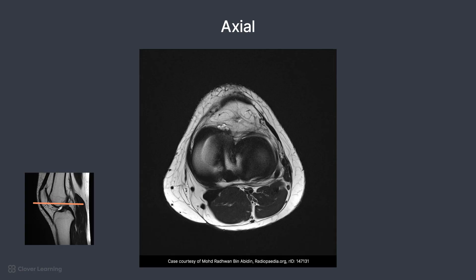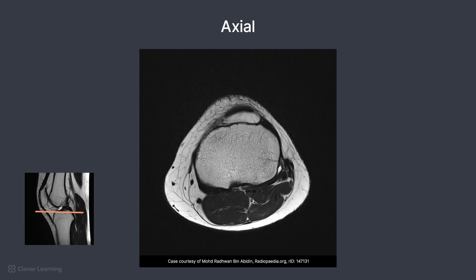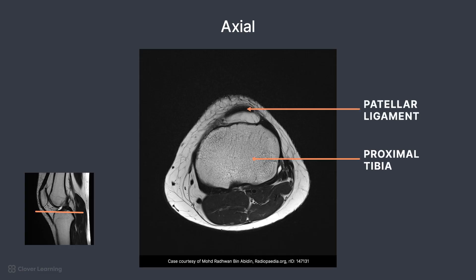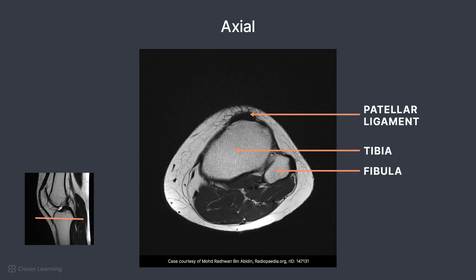The dark appearance centrally on this image indicates a slice cutting through the menisci. The medial head and lateral head of the gastrocnemius muscle are located posteriorly. Continuing inferiorly, the proximal tibia is demonstrated, along with the patellar ligament again seen anteriorly. On this last slice, the tibia and fibula are visible, with the patellar ligament attaching to the tibial tuberosity.